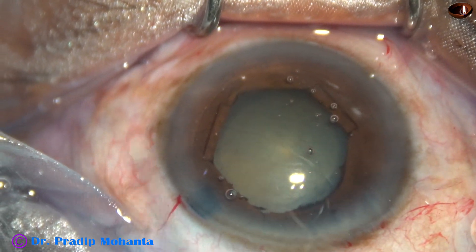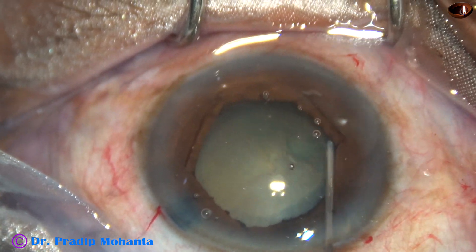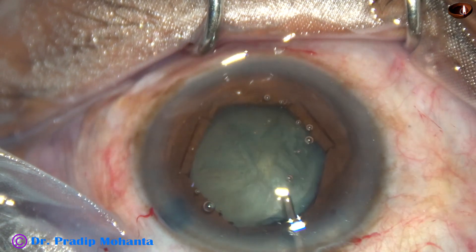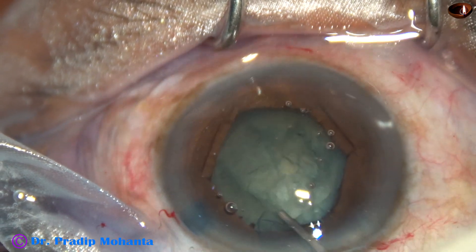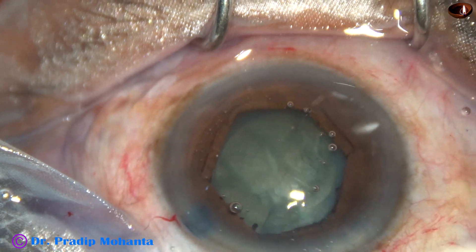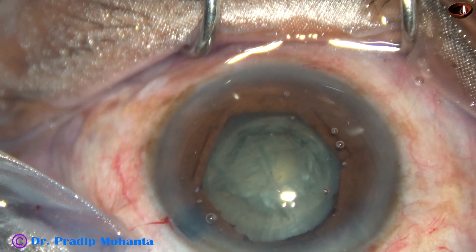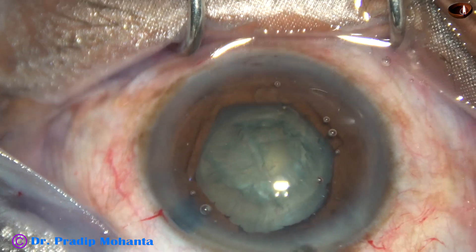And now hydrodissection is being done. Fluid wave is passed just under the anterior capsular rim. The nucleus is ballotted and I am sure that the nucleus is free from its capsule. I didn't rotate the nuclear mass in this case, but I am sure it is free from the capsule.